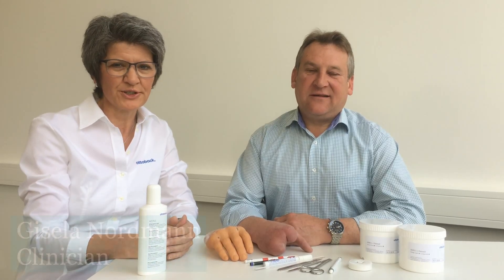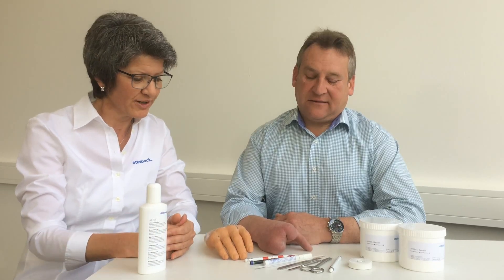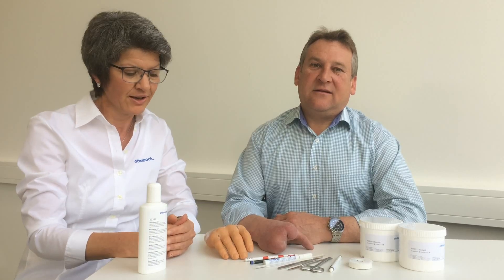Welcome to our tutorial about fitting a customized trial prosthesis from Ottobock Service Fabrication. I will demonstrate fitting a silicone partial hand prosthesis. This procedure can also be used for silicone finger and partial foot prostheses. A trial prosthesis is made to ensure that the definitive prosthesis fits perfectly. Here I demonstrate how to fit the trial prosthesis step by step.